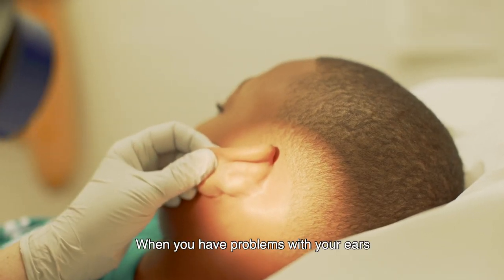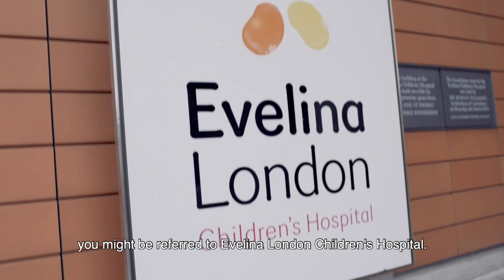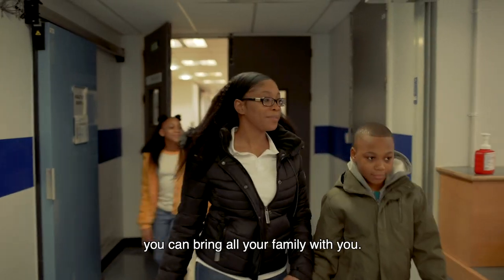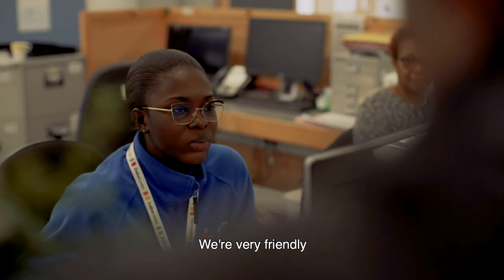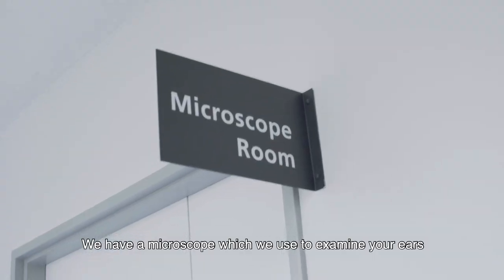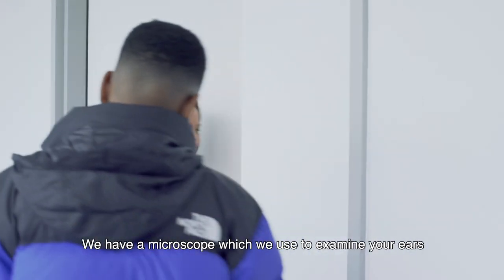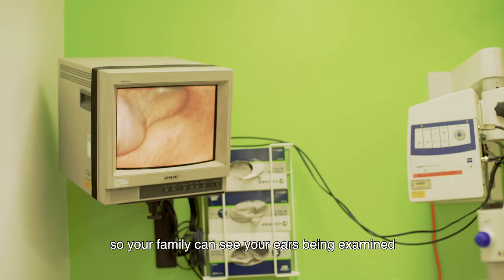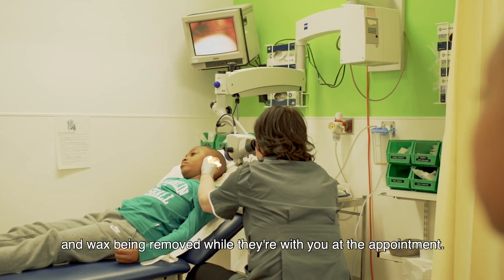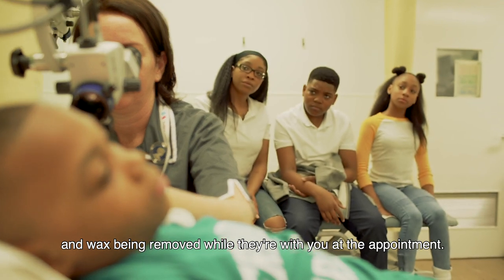When you have problems with your ears you might be referred to Evelina London Children's Hospital. When you come for your appointment you can bring all your family with you — we're very friendly and we will make you feel comfortable and safe. We have a microscope which we use to examine your ears, and that's connected to a TV so your family can see your ears being examined and wax being removed while they're with you at the appointment.